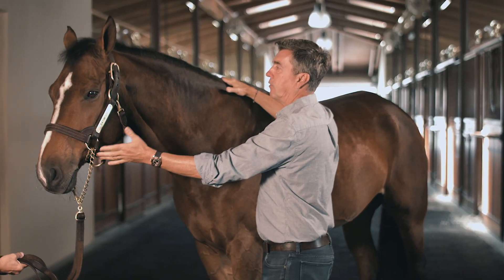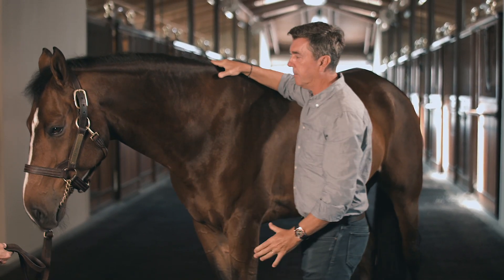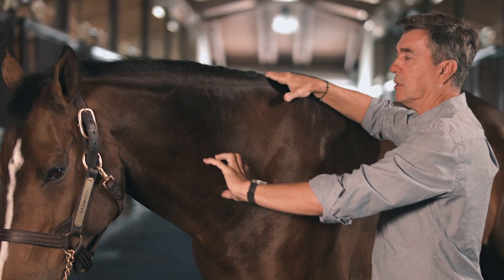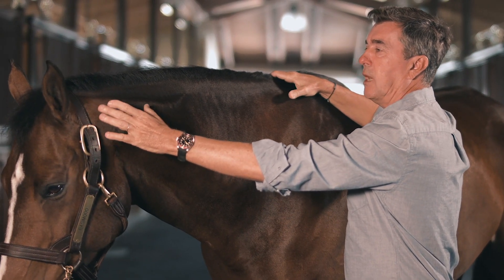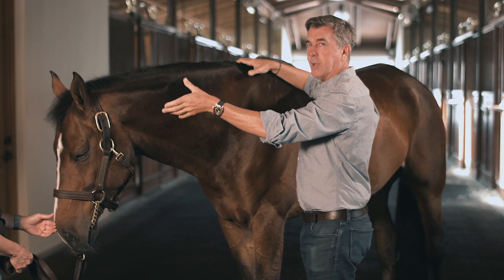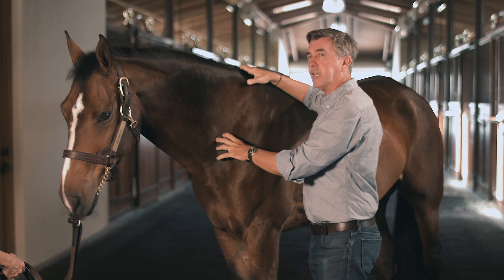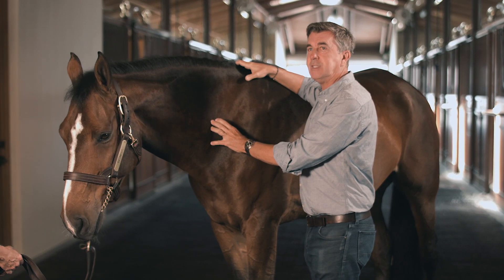This horse has a very neutral positioning of his neck, which is basically 90 degrees angulation with the head. The vertebral body axis is going to follow the neck and go down with two angulations and curve, starting from C1 and C2, which have a different type of angulation and authorize the horse to do the yes movement — up to 80% of that range of motion comes from these two vertebrae — while the lower vertebral bodies authorize the horse to do mostly lateral flexion and some up and down movement as well, especially for the lower part of the neck at the level of C6 and C7.